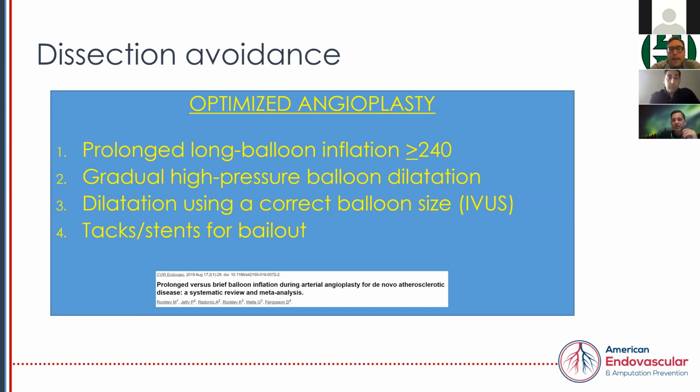The reason why I say that, and it's getting a little bit into the complicated aspect of what to use during the procedures, but oftentimes if you see different types of plaque, you may choose a different mode of treatment. And so I think prior to that, sometimes we would use a device and we would run into certain complications, and also those tacks.